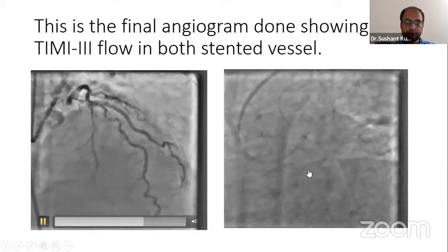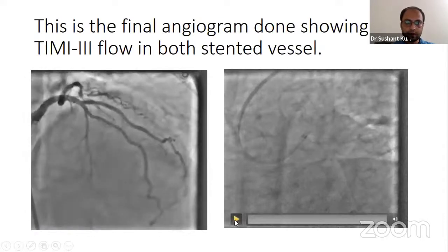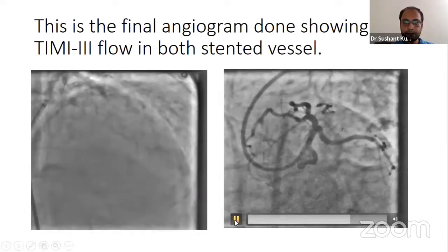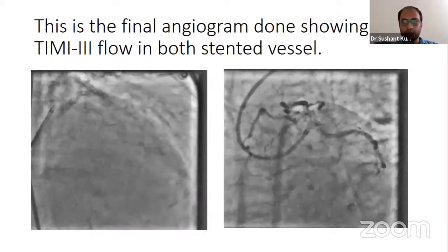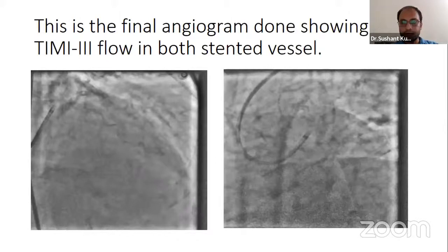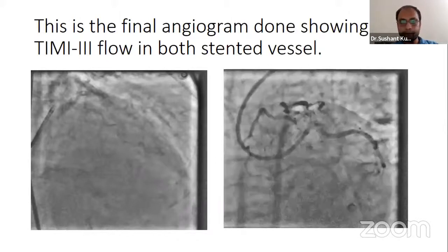This is the final angiogram, showing TIMI 3 flow in both vessels. LCx flow was also fine.